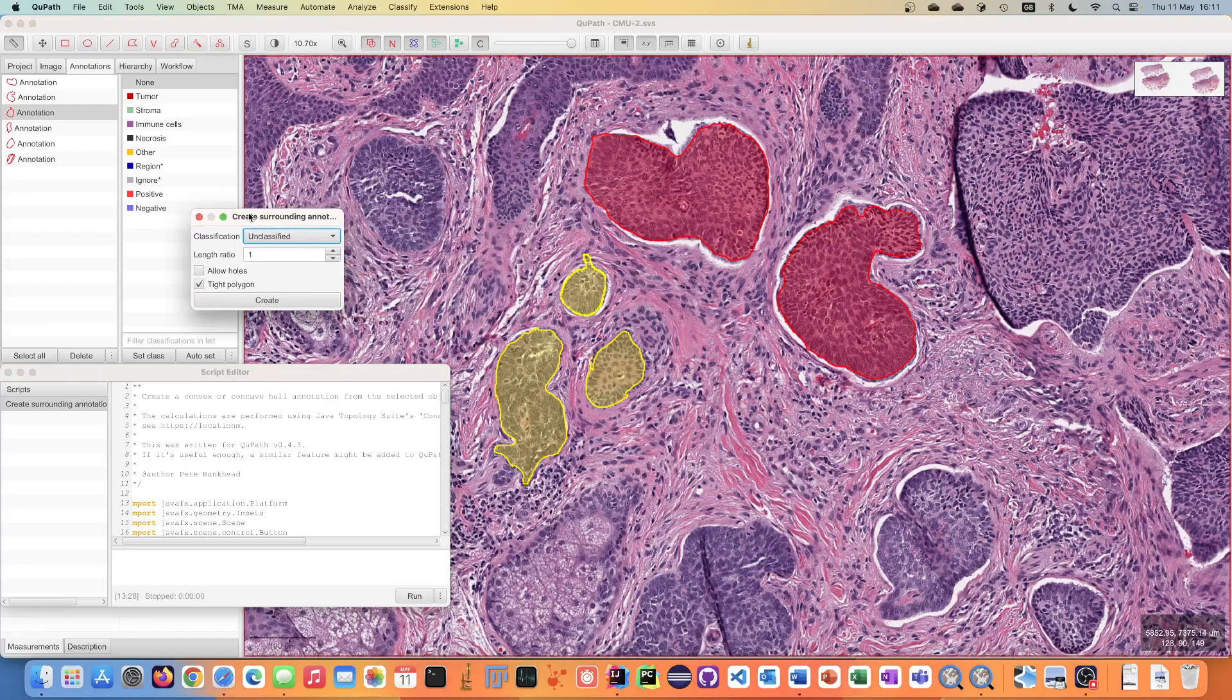Basically it tries to solve the problem where you might have multiple disconnected objects within QPath but you would like to create an annotation that surrounds all of them.